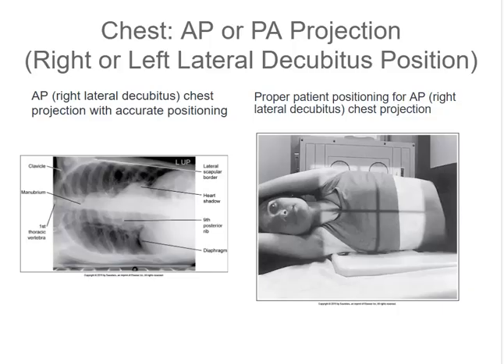Typically, patients will either rotate anteriorly on their side or posteriorly, just depending on where the IR is and how the projection is being taken. It's just more of a patient comfort thing, and like I said, the biggest concern here will be looking for rotation.